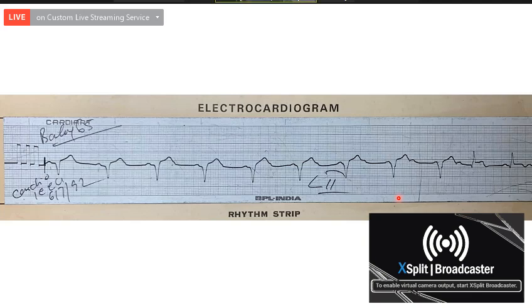So if all the criteria are satisfied, if you look at the RR interval, then the PP interval, there is some AV dissociation because the P is marching through the QRS complex. And it has come out to the T wave here. You can see the P wave very well here. Its P wave is here. And then what has happened subsequently? Sinus conduction. Yes, it is a conducted beat. This becomes a normally conducted beat.